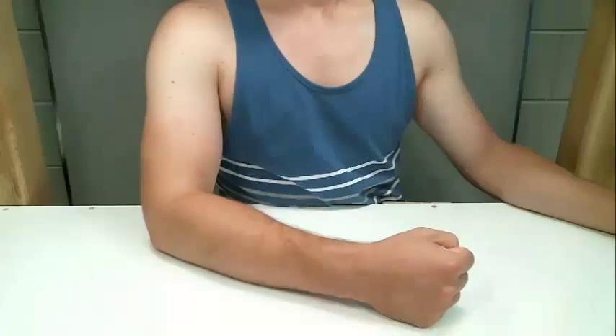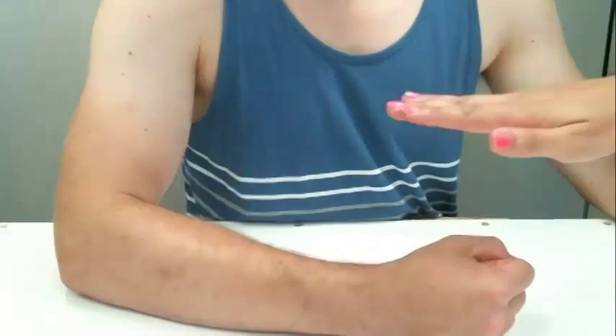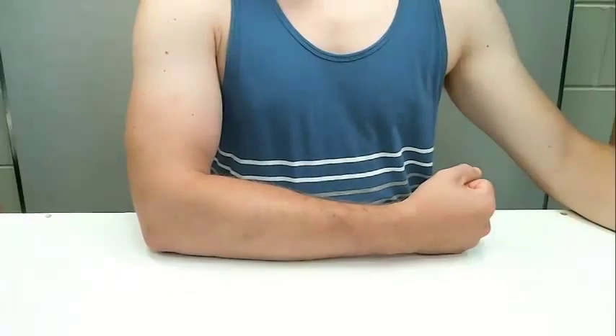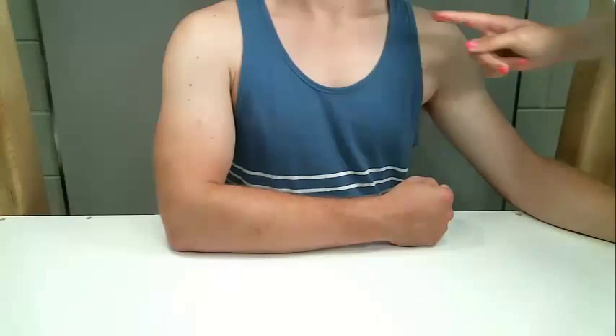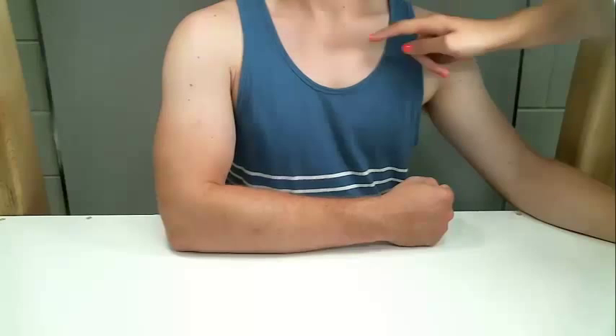The first step to prepare the participant for EMG is to locate the muscle of interest. In this example, we will use the biceps. Have the participant try to flex at the elbow while resisting a force. This will activate the muscle and help locate the muscle belly. The ground is a reference point whose activity is compared to the activity of the muscle to reduce the noise in the signal. Choose a bony area close to the muscle of interest where there is little skin movement for placement of the ground electrode. Essentially, the ground should provide no electrical output.